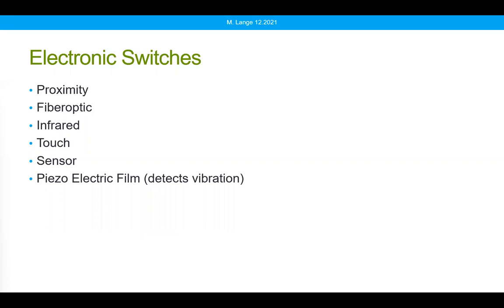No, sorry. There's not one that I'm aware of that can be activated by eye gaze. Of course, you can activate some devices by eye gaze. There is a switch that can be activated by an eye blink. The only one that's still on the market is from Enabling Devices. They have an eye blink device. It is often worn on a pair of glasses. There's a switch that's looking towards the eyelids, and as the person intentionally blinks, it will capture that.